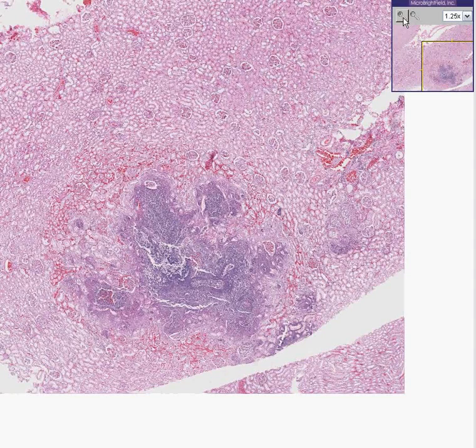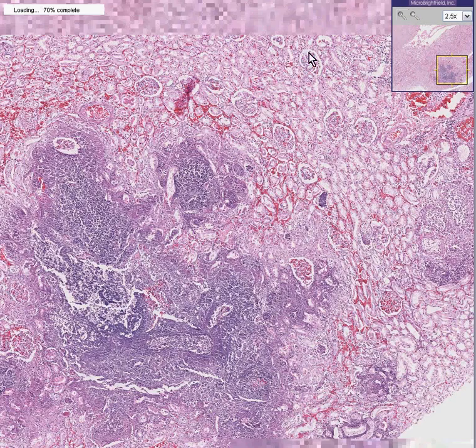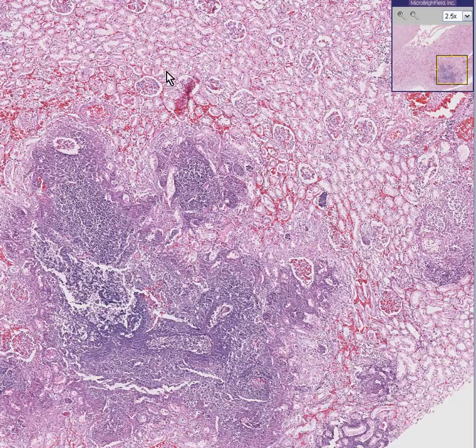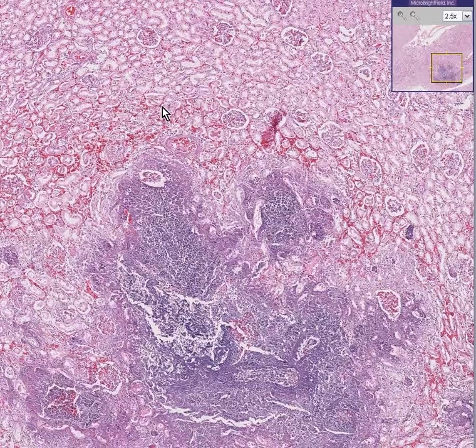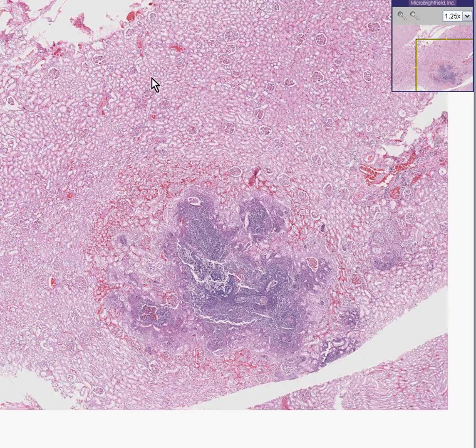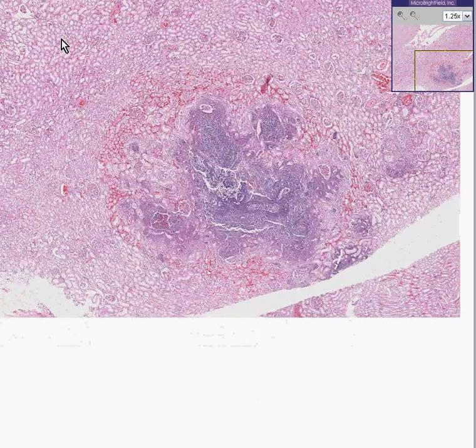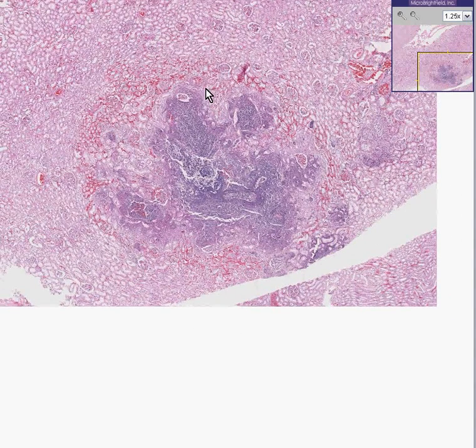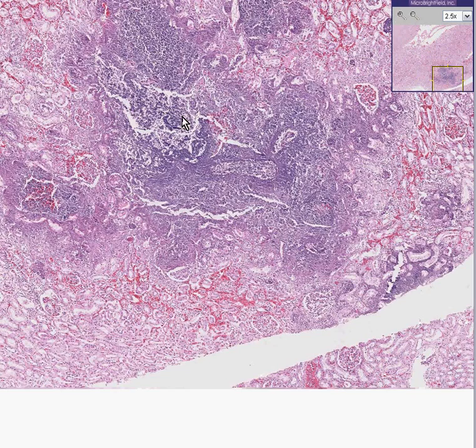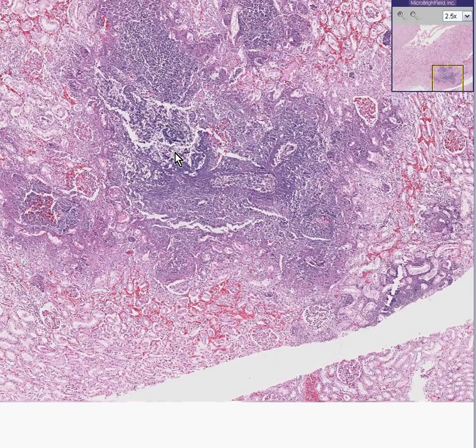It wouldn't take very long before I could instantly convince you this is a kidney. You can see nice glomeruli, nice tubules. What instantly strikes you as being abnormal is that within this histologically normal kidney, you see a big blue irregular but fairly well-defined area.